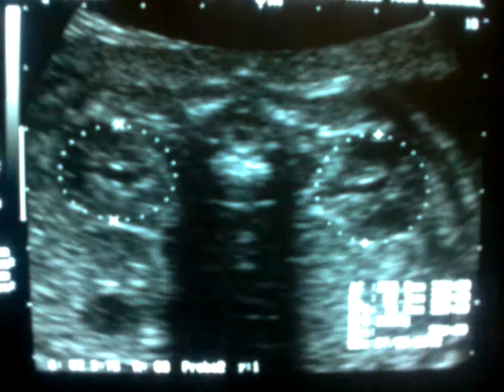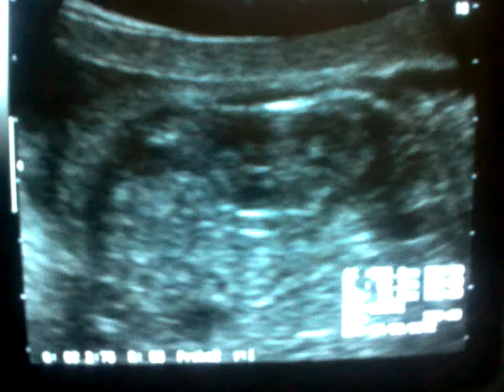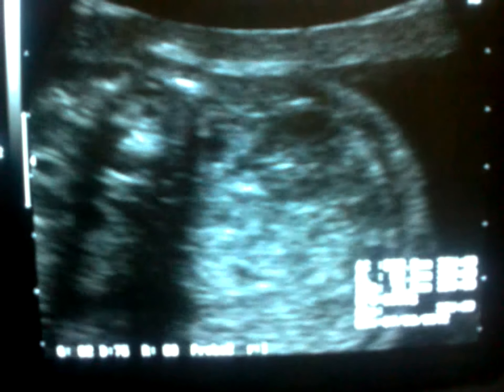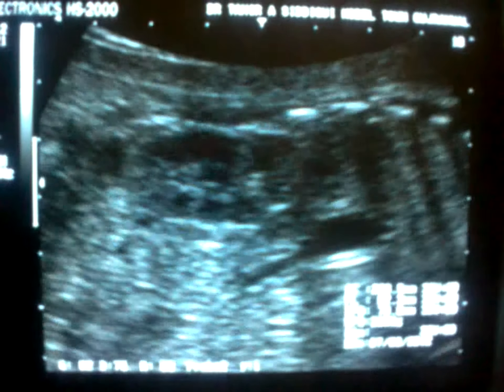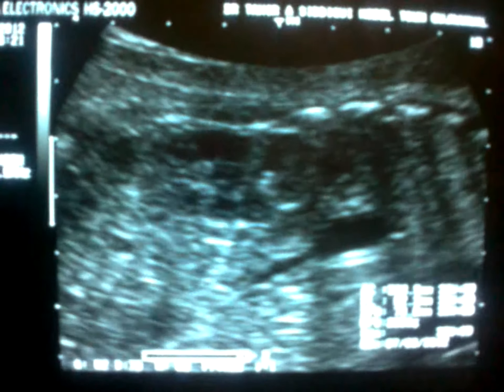This is the transverse section of the fetal abdomen showing the kidneys in transverse section. I then rotate the probe 90 degrees to get the kidney in the longitudinal section. This is the fetal kidney in longitudinal view.